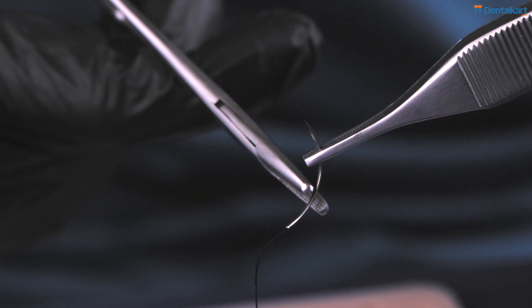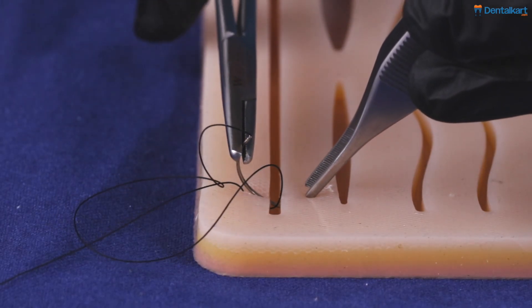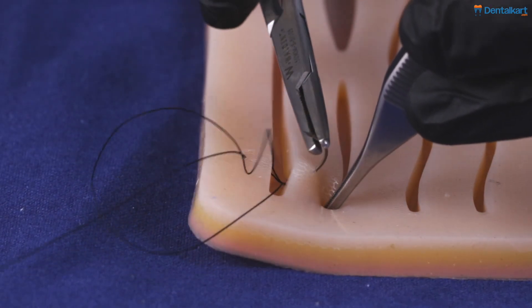The main point is to use wrist motion to take the bite, so that you don't damage the tissue from translatory motion.